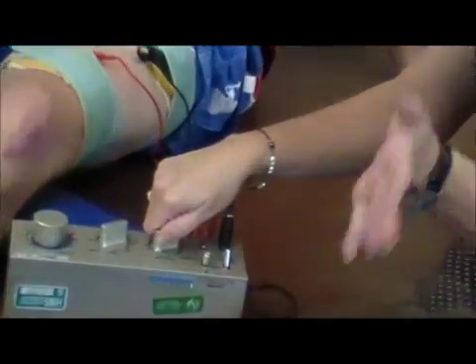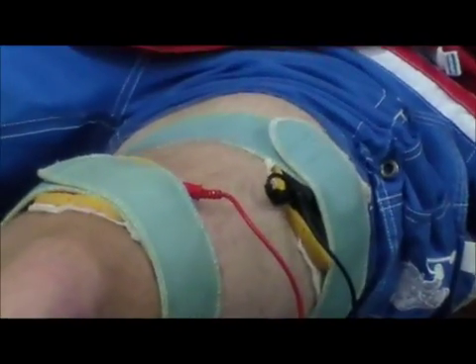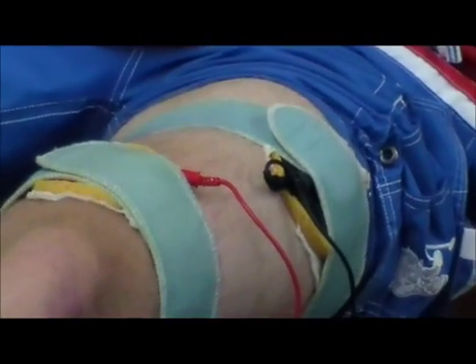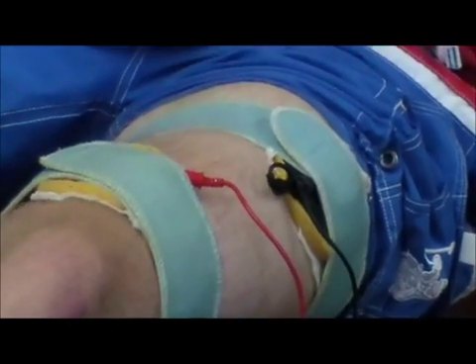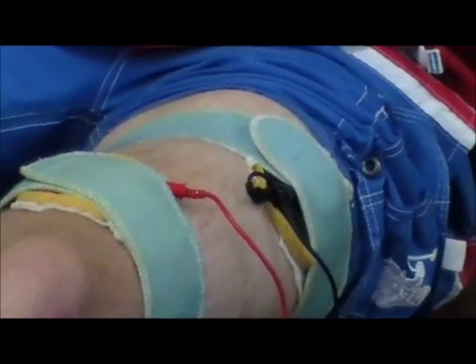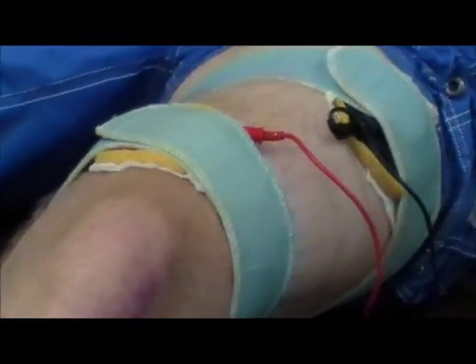Now 4, I'm going to go ahead and switch because it's still continuous low rate, should be the same. But it's going to do, hang on, there it goes, 5 pulses per second. So why was it pulsing earlier on the continuous? It wasn't pulsing, it was just my muscle contraction. You have to have a threshold before it fires off the tetanic response. It was getting there. I didn't have quite enough intensity to fire off.